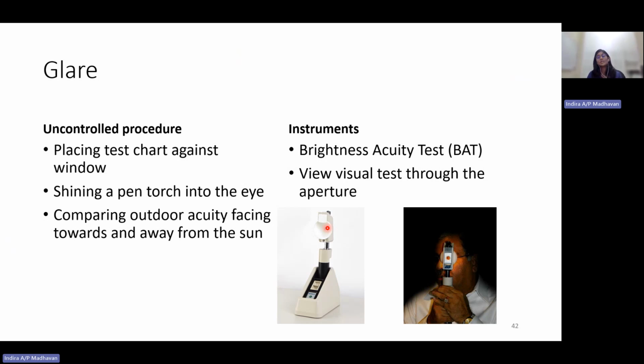The reason I'm not discussing that is because there is no change in the instrument that we are going to use to measure the patient, and also no modification in terms of the procedure. The pupil reaction test, we still perform the same way as we do for normal people. Motility test, also the same. Confrontation test, also the same.